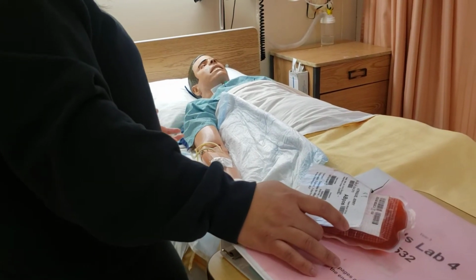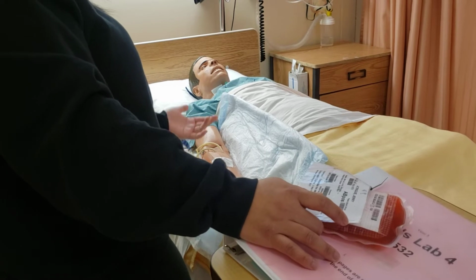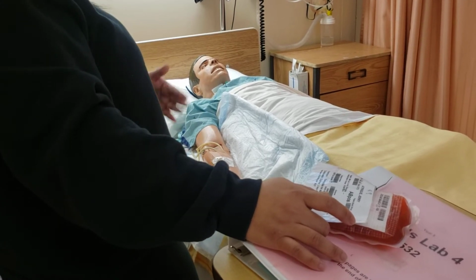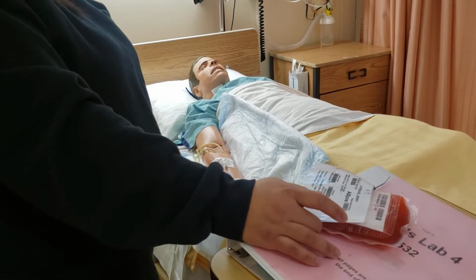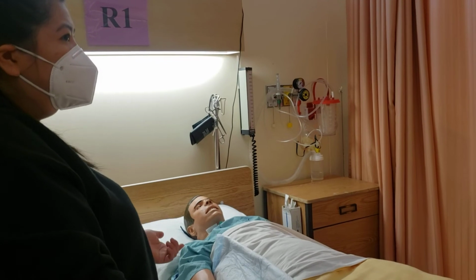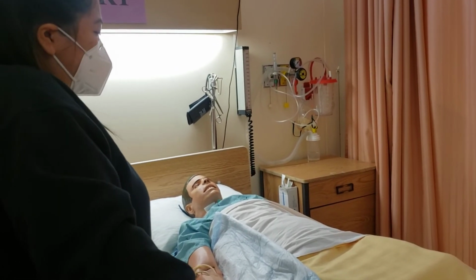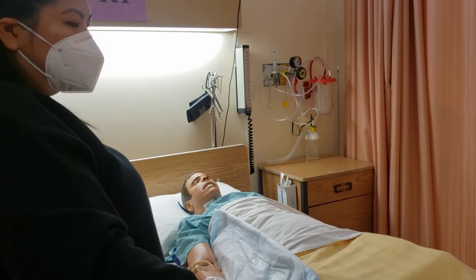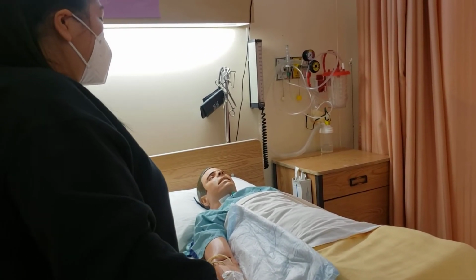Like I said, I'll stay here for 15 minutes, but even after the 15 minutes is up and I'm not in the room, you can hit your call bell anytime to let me know. Do you have any questions for me? I'll also let you know that we'll be recording the blood products that you receive. We'll record it on the sheet called the cumulative blood product record. That just goes in your chart.